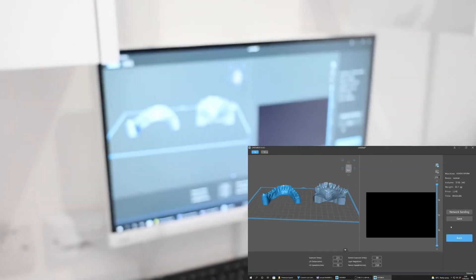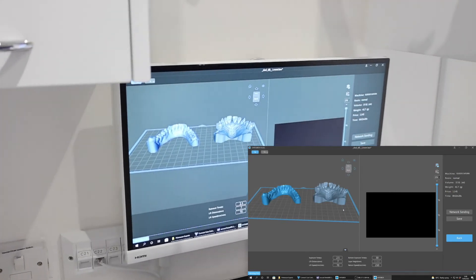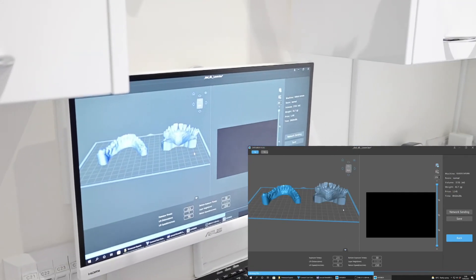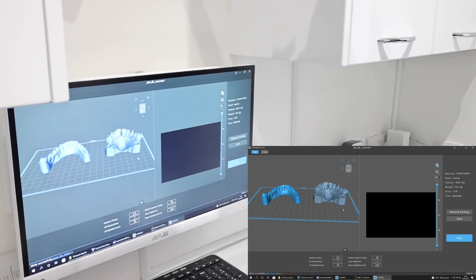Slice and save. That sliced file then gets taken to the 3D printer and the models are produced.